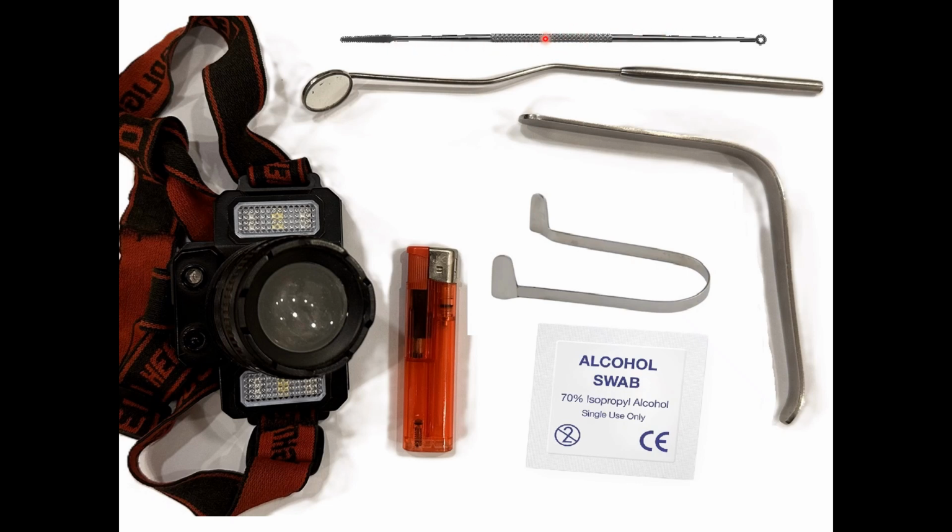This is not indicated in every examination, but if we have to differentiate the inferior turbinate from any nasal mass, we do probe test. We pass the probe around that mass. If the probe passes all around the mass, then that mass is an external mass. But if the probe is not passed laterally, then it will be the inferior turbinate, because inferior turbinate is arising from the lateral wall.